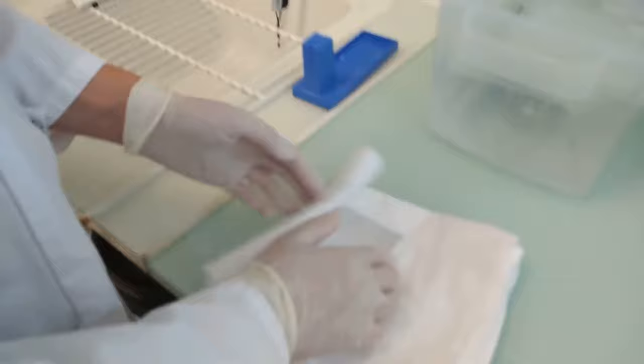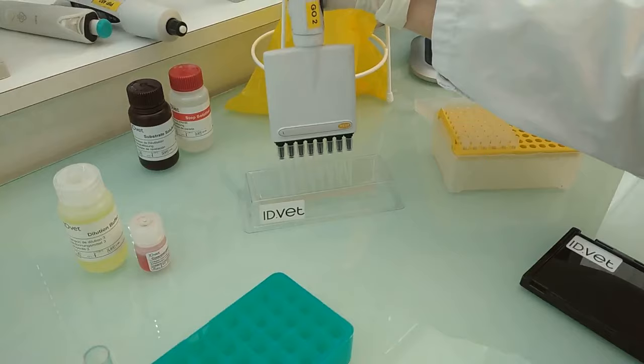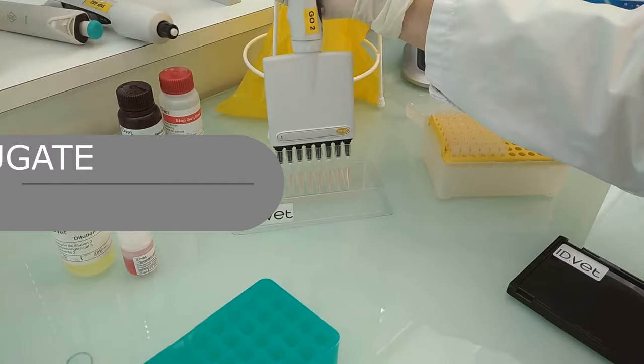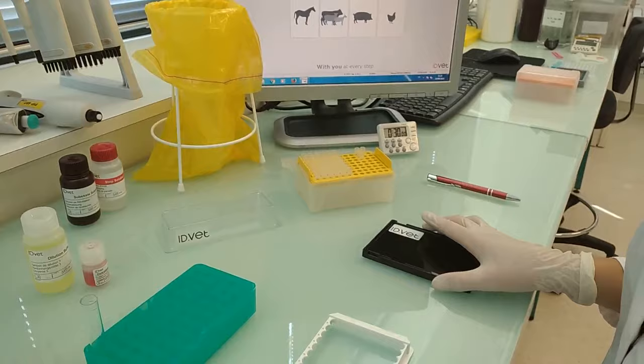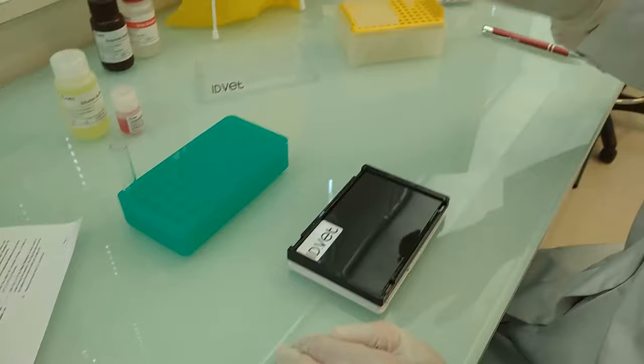Before adding the conjugate, the wells should be completely dried. Conjugate step: Add 100 microliters of the conjugate 1X to each well. Cover the plate and incubate 30 minutes at 21 degrees.